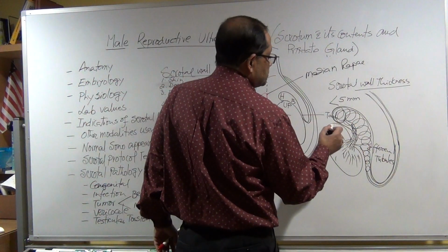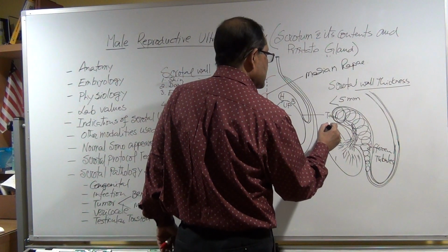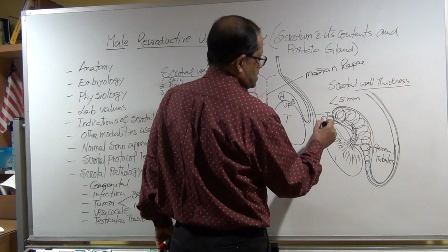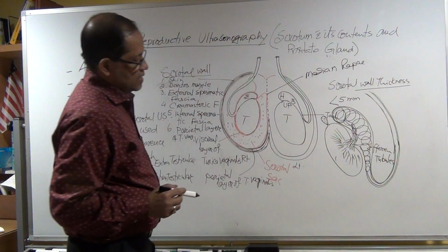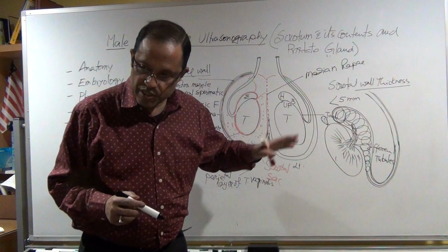So now, sometimes there's an appendix testis. This is a fetal remnant, is non-pathogenic.